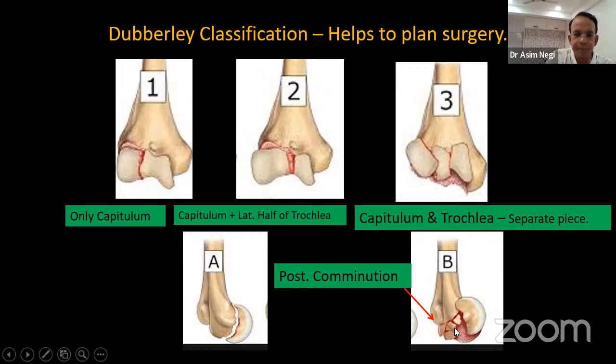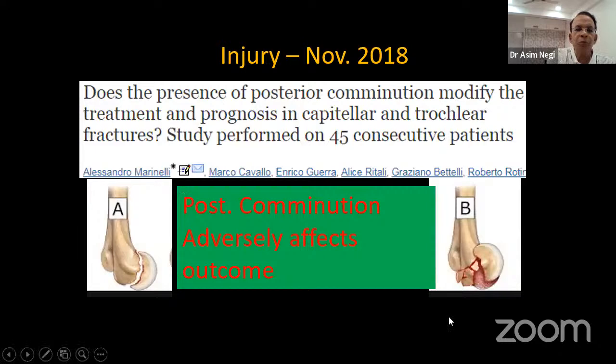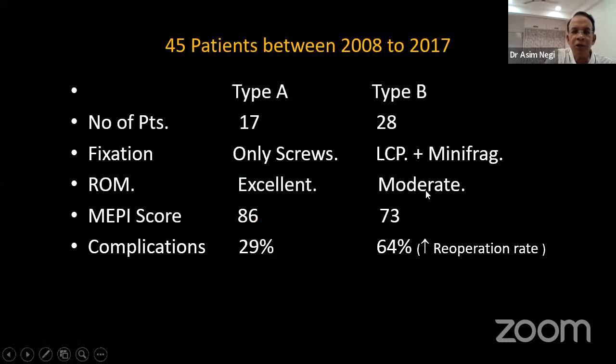This excellent study clearly showed that presence of posterior comminution adversely affects the outcome. Once there is posterior comminution, you are expected to use locking plates and mini fracs and buttress the comminution. Range of motion achieved is only moderate. The functional scores were poor, and the complication rate also shoots up from 29% to 64%, which includes a higher reoperation rate in comminuted fractures.